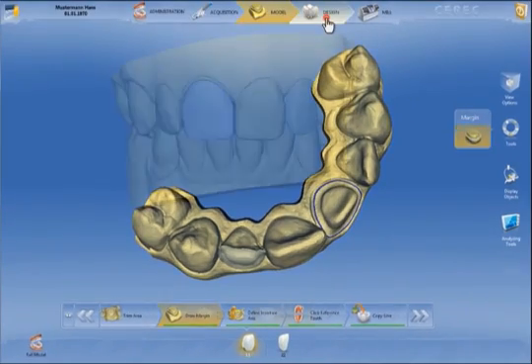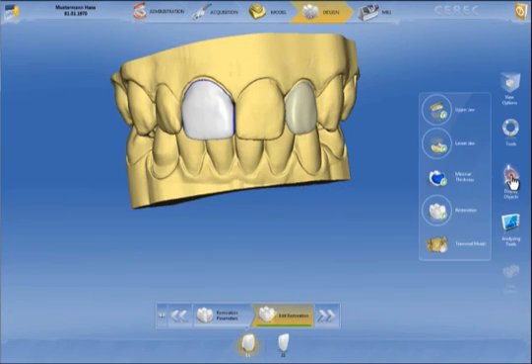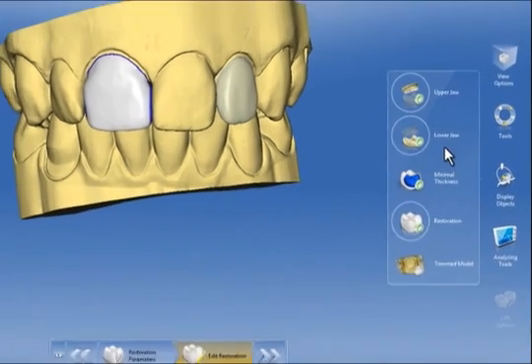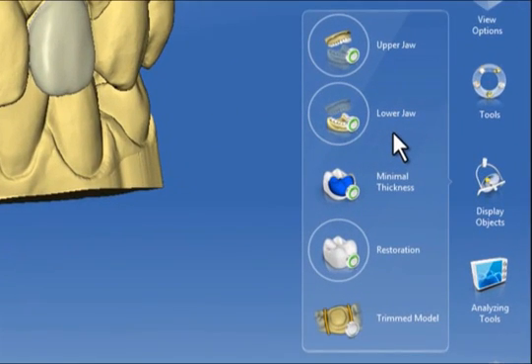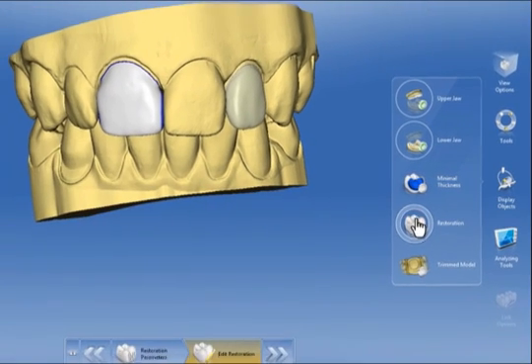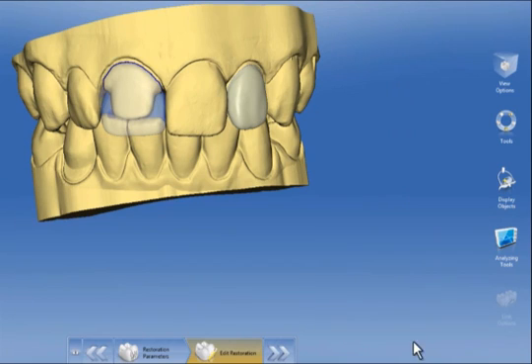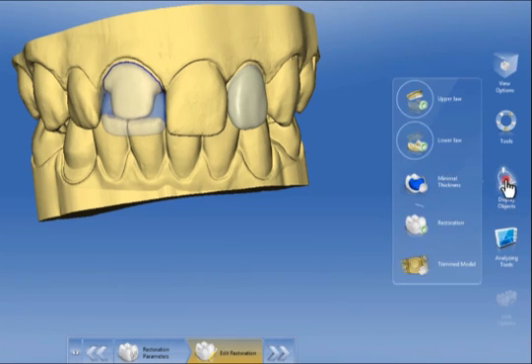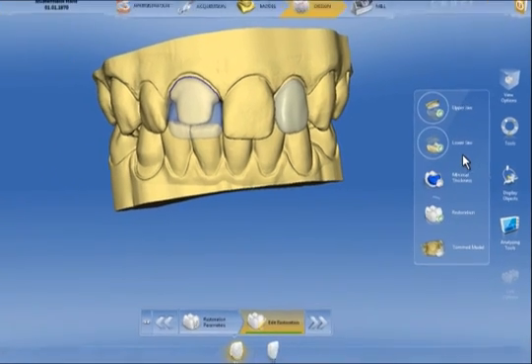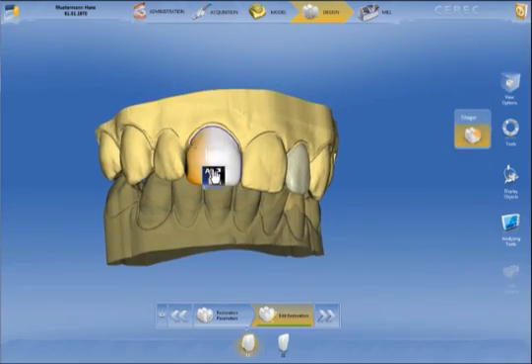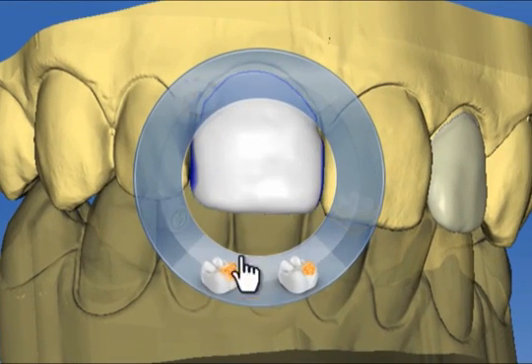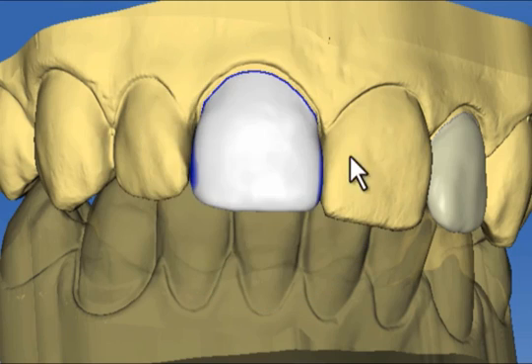In the design phase, the restoration proposals are created and can be further modified. At the right-hand edge of the screen is the side panel with which we can change different visualization options such as the transparency of restorations. Changes to the design are made using the tool wheel, which we will address separately.